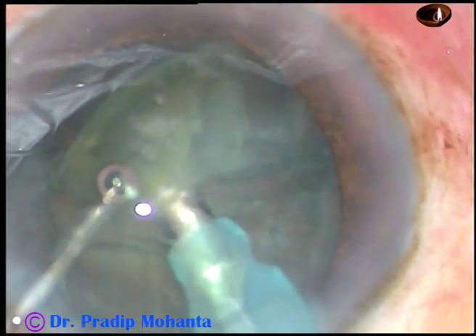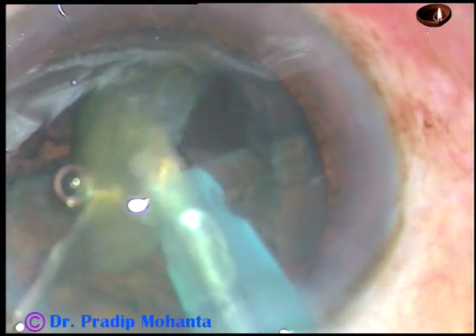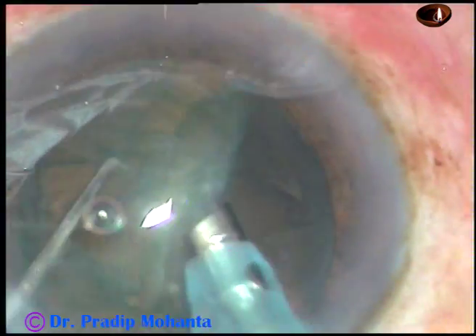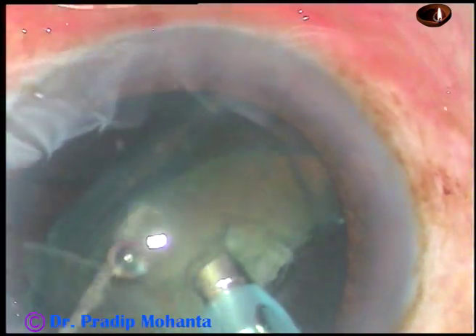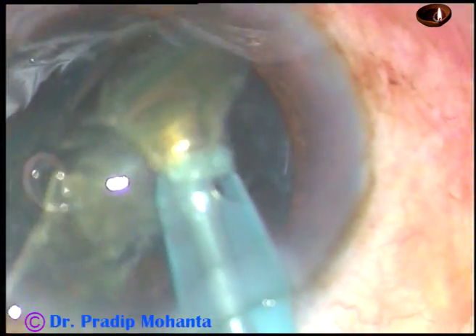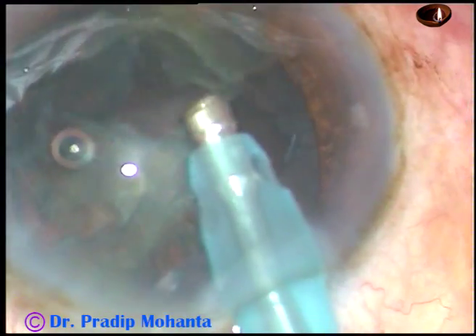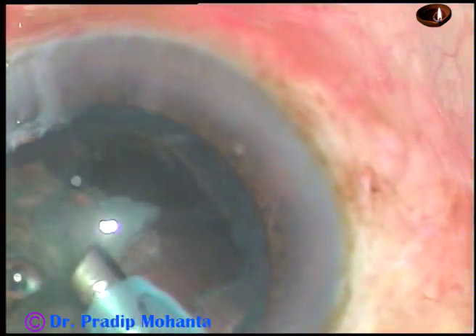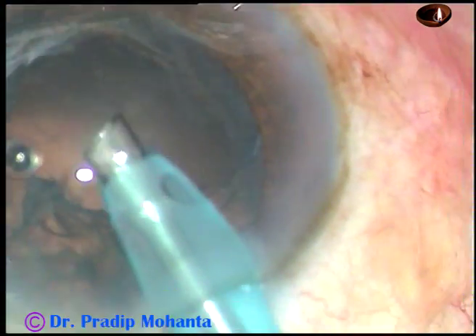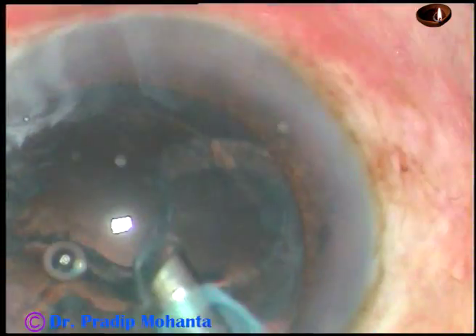This hemi-nucleus is emulsified and removed in no time. Now this is the other hemi-nucleus — it is divided into two parts, and each part is emulsified and taken out. FACO power used in this case is 60%, flow rate is 45 ml per minute, and vacuum is 450 mmHg.